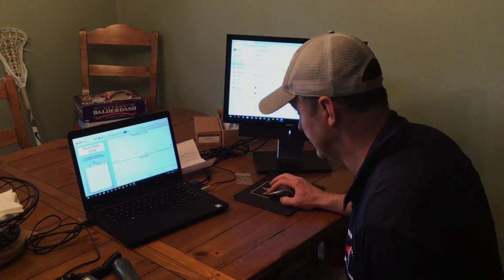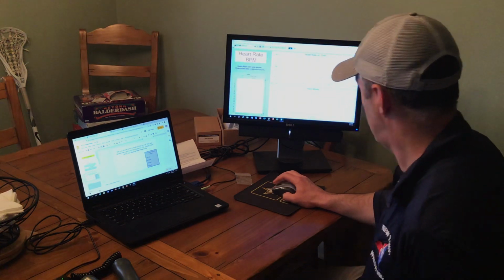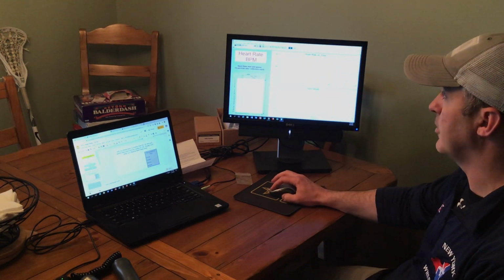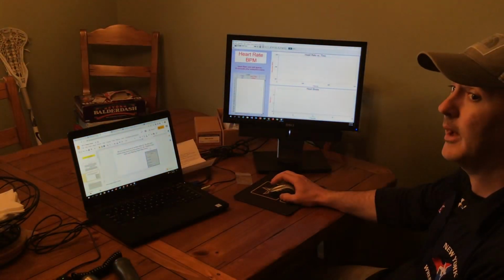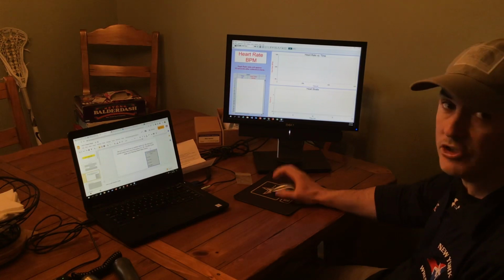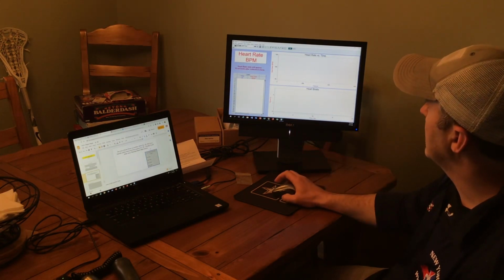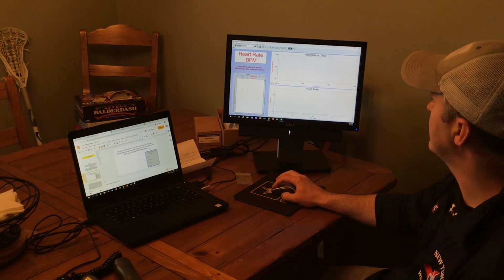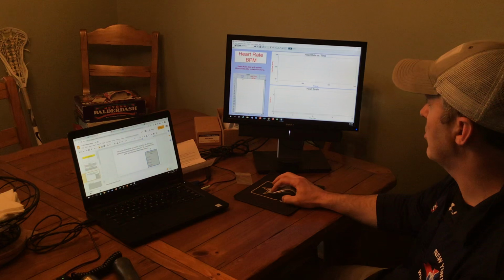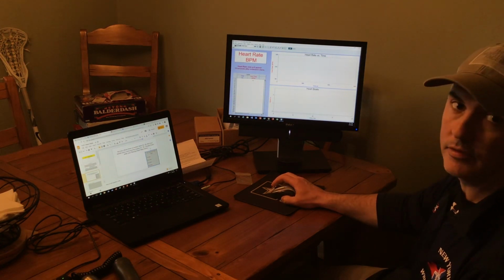Now, in PLTW, you know how they love Logger Pro software. And so what I did was I opened Logger Pro, the same way we did other labs when we were trying to measure data. Open the physiology link, and then there's a heart rate program in here. You can see up here, it's heart rate versus time, and these are actual heartbeats. And then this is over seconds. It's going to tell you what your heart rate is.